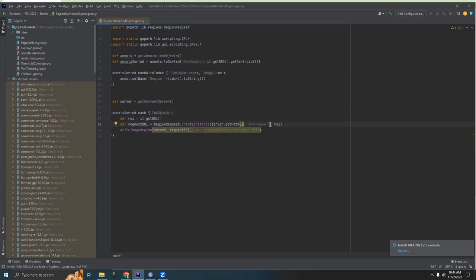For the moment, I want a high resolution image with a downsample value of 1. If you've chosen very large images, like whole big tissue regions, you might want to increase the downsample value to decrease the final file size. And this is referencing the region of interest we've defined here. And then the final function is just write image region using the server we defined up here, the request we've defined here, and then path. So we're gonna have to actually spend some time defining this path.